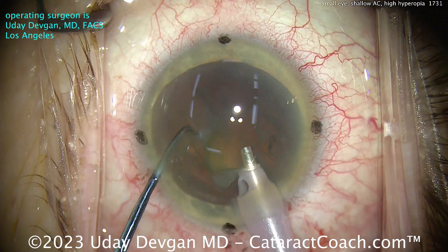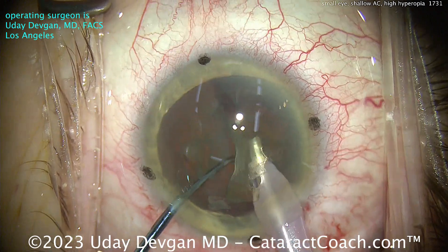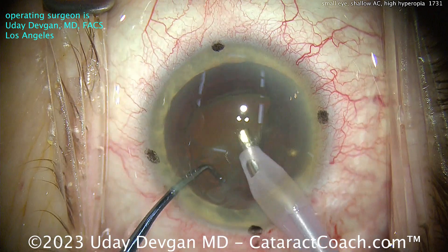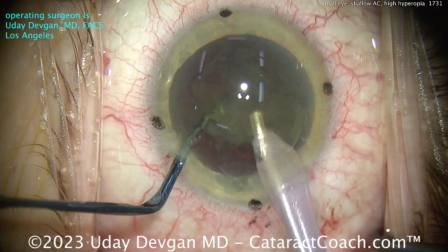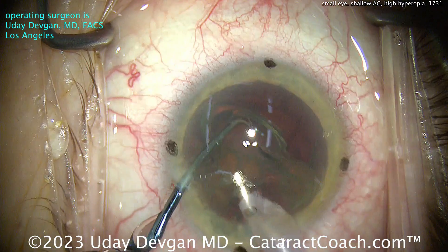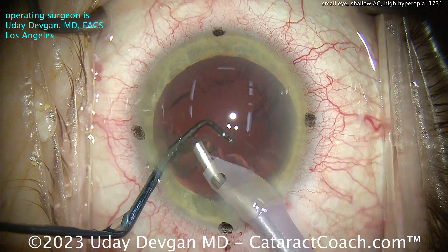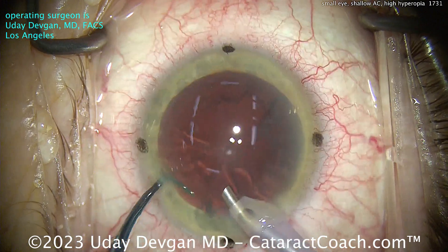The first half is brought up and emulsified. Luckily it's not too dense of a cataract — pretty much a routine case for us. We're emulsifying nice and easy, using phaco power modulations such as burst or pulse mode to really minimize the amount of energy placed in the eye. The second half comes up again, using that chopper to keep the piece in front of the phaco tip. Just a bare minimum amount of phaco energy is needed, and even a small degree of fluid is going through the eye — we can do these cases with very little fluid running through the anterior chamber. Last piece coming up, chopper in the safe position just to be sure.